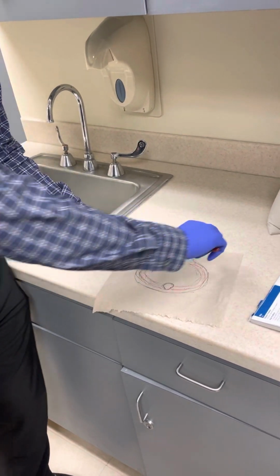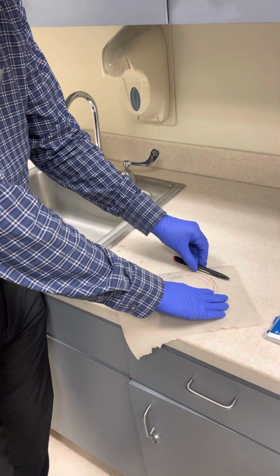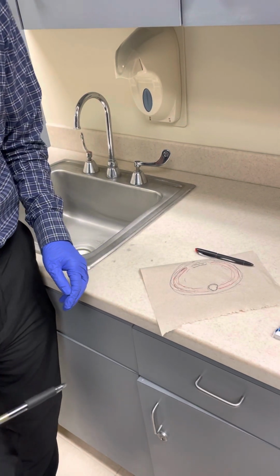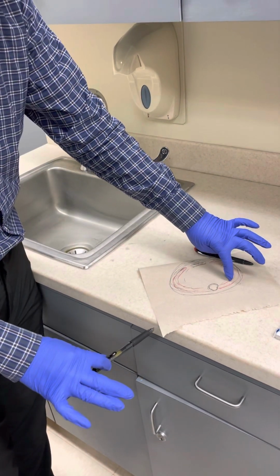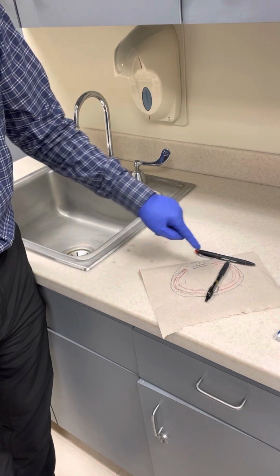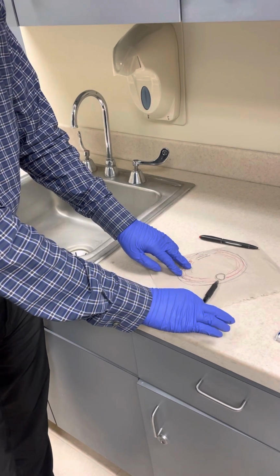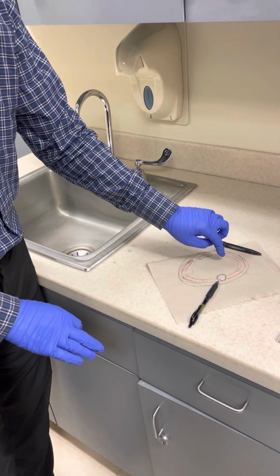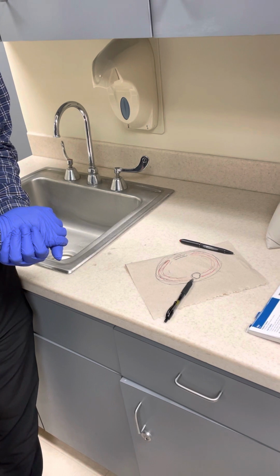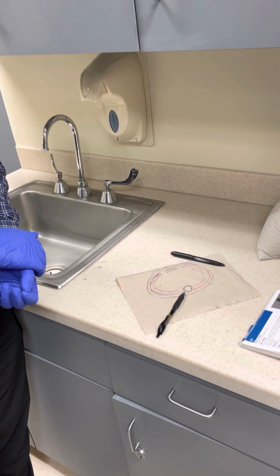Okay, so let's say that we have our IR, okay? And we said that our IR here, Mansi was in an RAO like this, correct? So, if the X-ray beam is coming this way, right? And it's coming through the patient's, which side is this? Right. Right side. So there's our X-ray beam. What do you see on top of these ribs? The spine. That's right, the spine is gonna be projected on top of your right ribs. It's gonna be superimposed on those right ribs. If you're looking at the right ribs, do you want the spine on top of them? No, so this position cannot be used to image the right ribs, right?